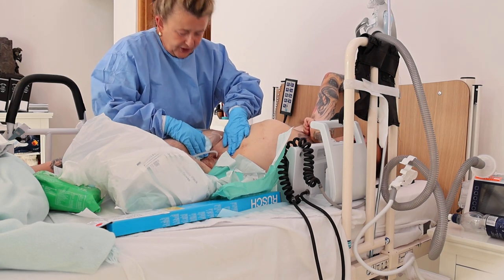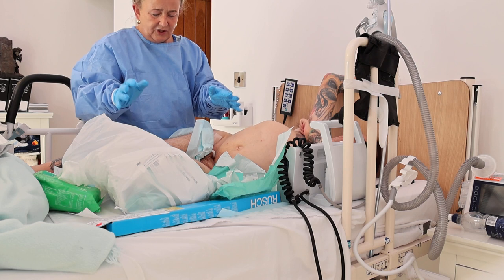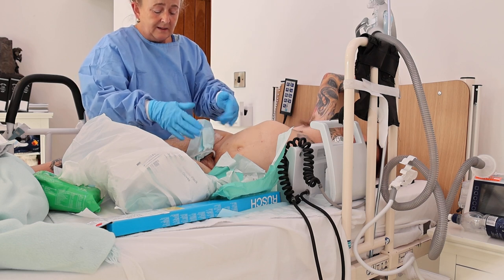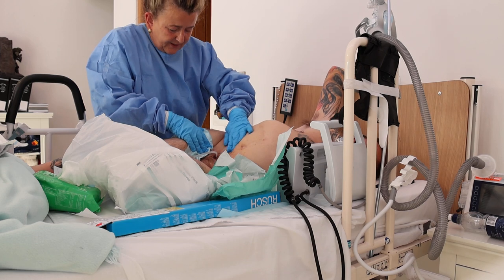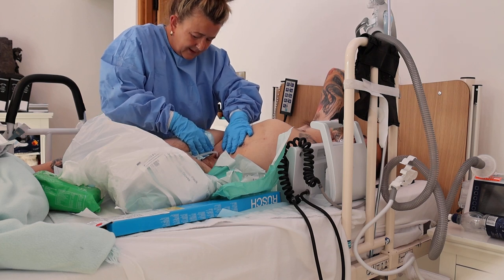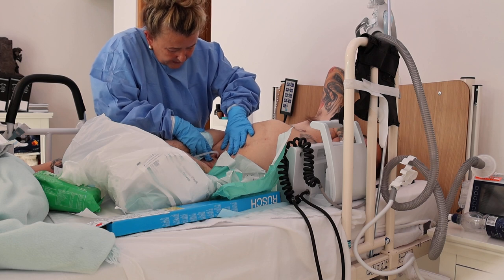So I'm just going to show you how clean it is after a suprapubic catheter change. It's super duper. I've got none of that smell, hence why I'm not wearing a mask. I never wore masks years ago and I'm not wearing them now, because we never used to use them. Oh, there's so many sediments coming out. So that is what you call a suprapubic catheter change.